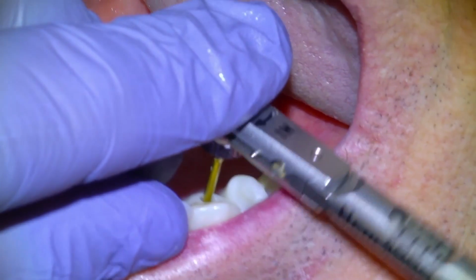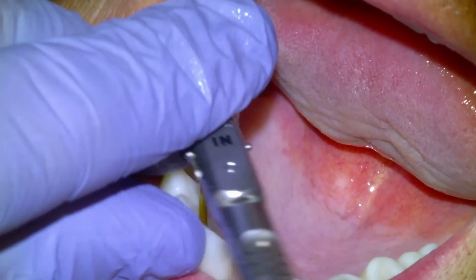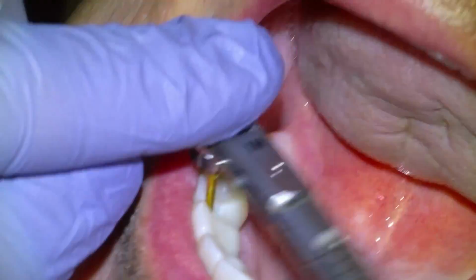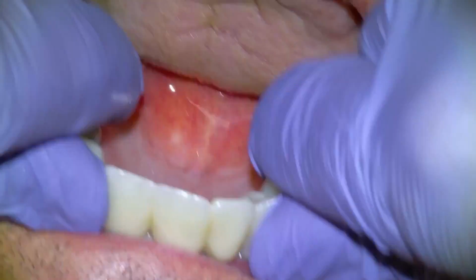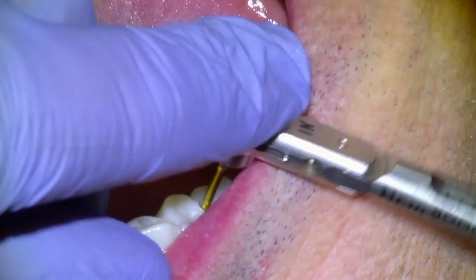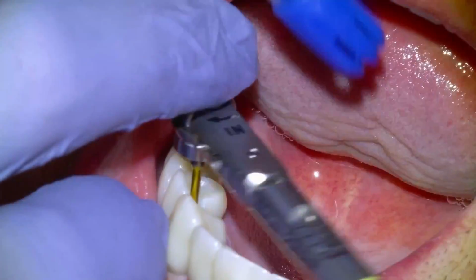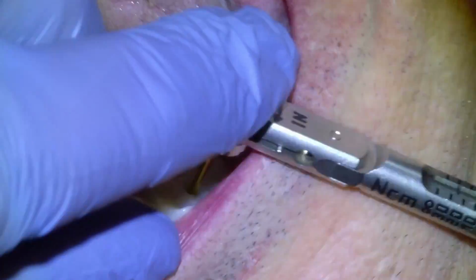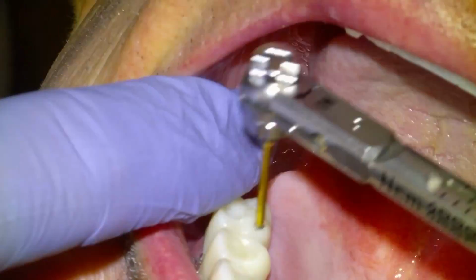And that's important for a long-term result because implants can get gum disease just like teeth can. So what's the maintenance that goes into maintaining something like this? I'll give this thing a big shake, by the way, before tightening it down fully, just to make sure that everything is fully sat. These things can fracture when you're installing them if it's not designed properly, or if you torque it down too fast.